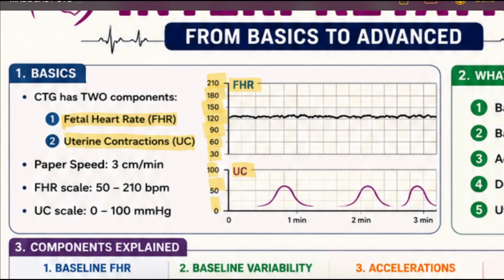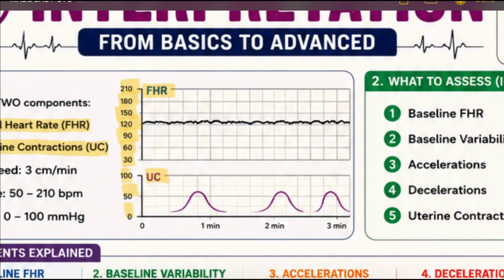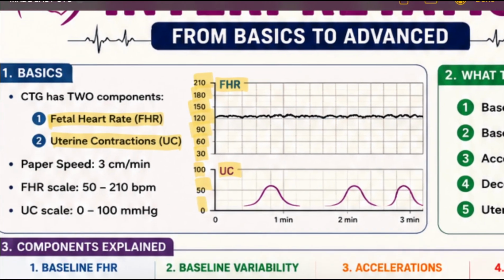So why do we perform CTG? The main purpose is to answer one important question: is the baby receiving enough oxygen or not? If oxygen decreases, the baby's heart rate changes before permanent brain damage occurs. That is why CTG helps to detect fetal hypoxia early.